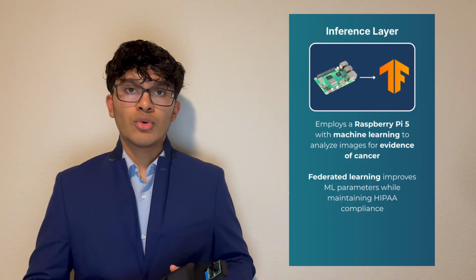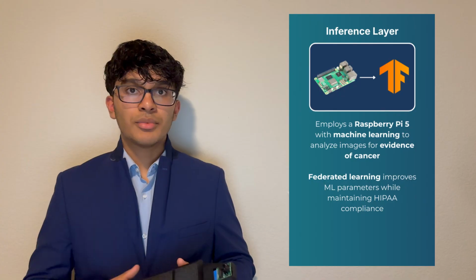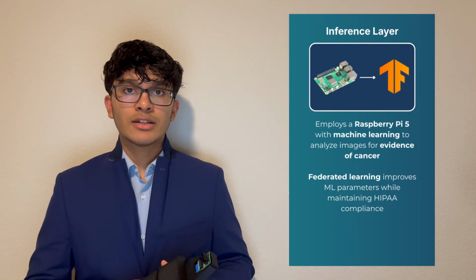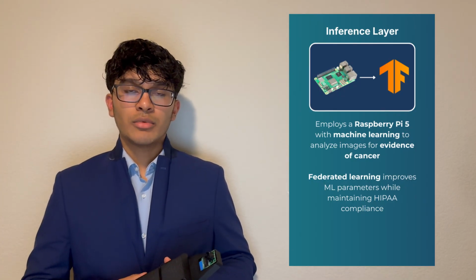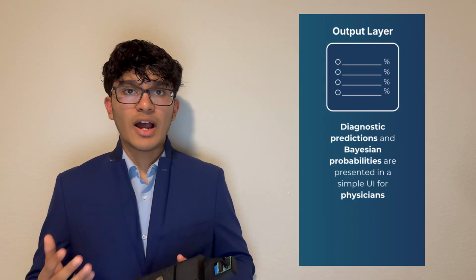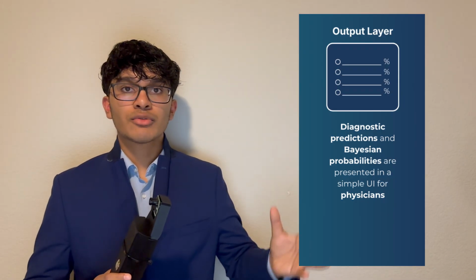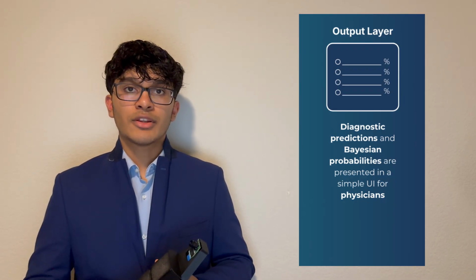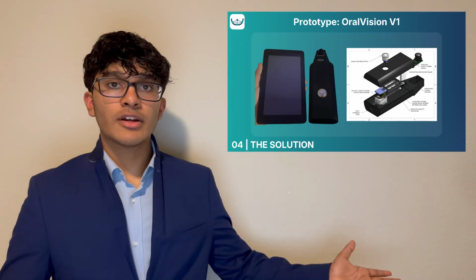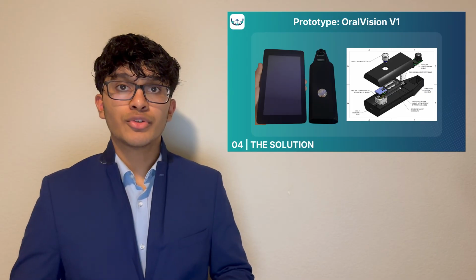User data is stored locally on the device while only the model's parameters are updated in a central terminal, protecting user personal identifiable information while continuously improving the device and its capabilities. Finally, the diagnostic predictions and their probabilities are displayed on a screen for the physician to use during their final diagnosis.